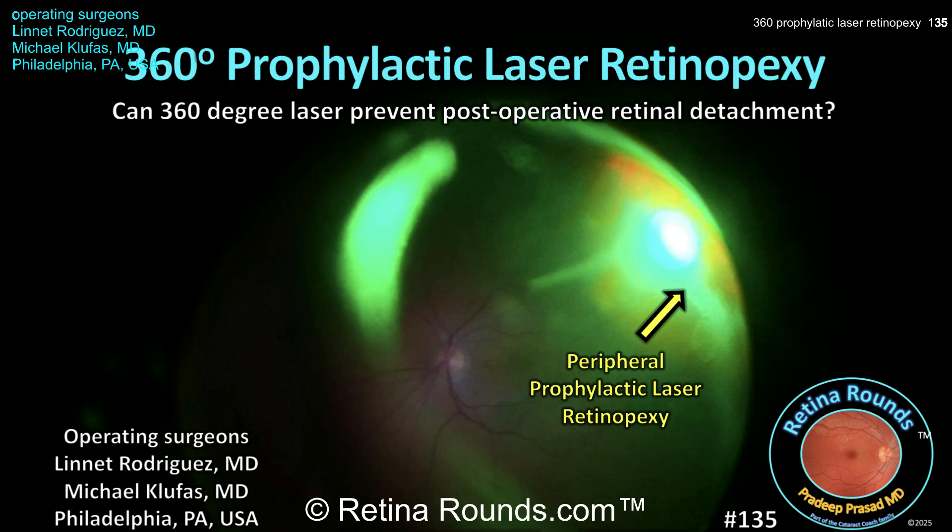The patient in today's video, presented by guest surgeon of the week Dr. Michael Klufus, is undergoing a vitrectomy for an epiretinal membrane and symptomatic floaters. Of note, the patient has previously undergone laser barricade of a localized peripheral retinal detachment. To prevent a postoperative retinal detachment, Dr. Klufus and his fellow at the time, Dr. Lynette Rodriguez, performed prophylactic 360-degree laser retinopexy.